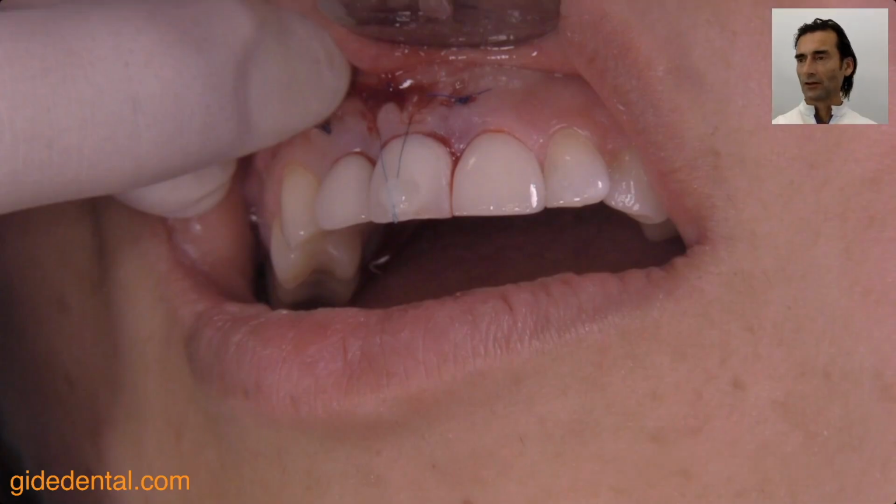At this moment, we have moved the patient into a much better position than before. We have moved the gingival margin, thickened it, controlled it. We have placed the bone there so it supports the buccal plate.